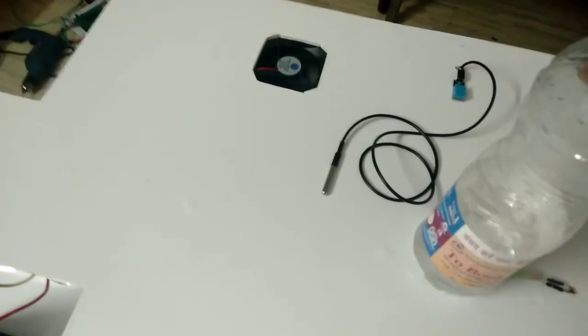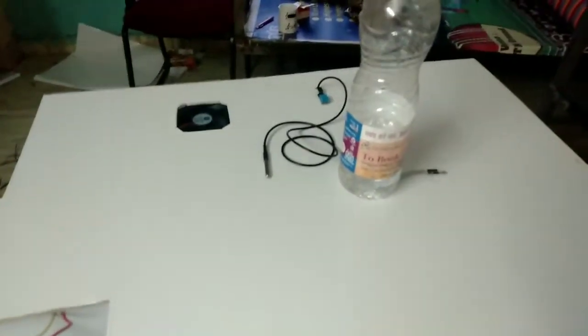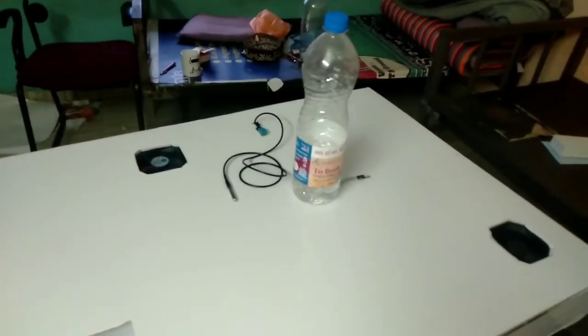So when I start the system, for example, when I place something on the force sensitive resistor, that is, pressure is applied, you can see the fans are running. When the pressure is applied, the fans get switched on, and you can see the circulation begins. When the system starts, it takes a few minutes to get heated up.